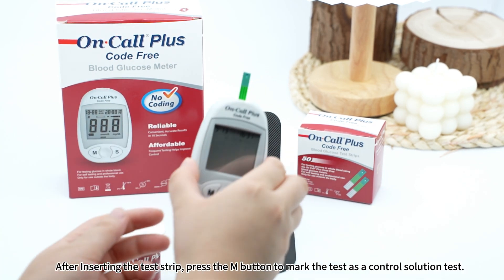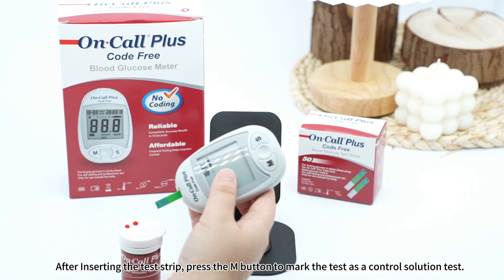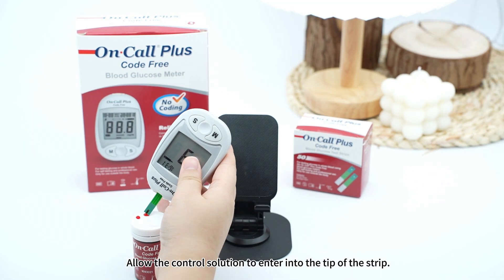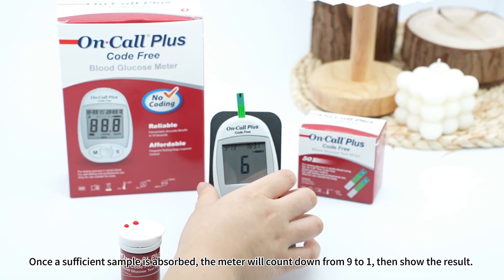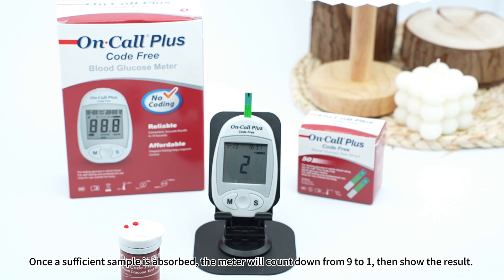After inserting the test strip, press the M button to mark the test as a control solution test. Allow the control solution to enter into the tip of the strip. Once a sufficient sample is absorbed, the meter will count down from 9 to 1, then show the result.